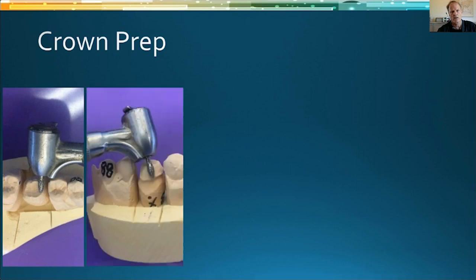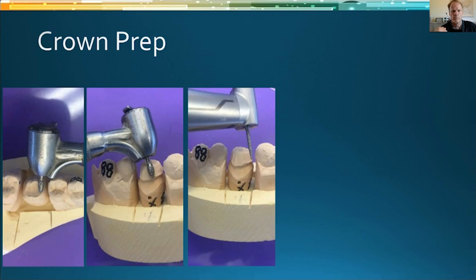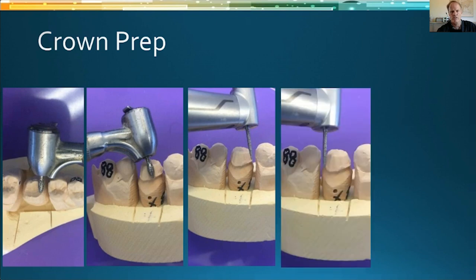Occlusal reduction with a football. And then axial reduction as well. I go at the gingival margin. I'll cut through my proximal slice. A nice handpiece and a good bur will paint through that one slice right through the proximal, is what you're hoping for. And then you just have to blend those line angles and do some margin refinement with the cylinder.